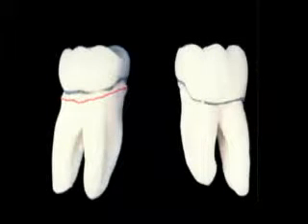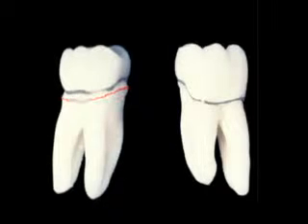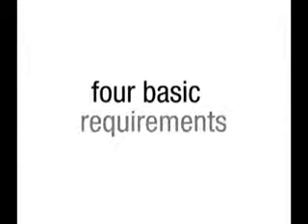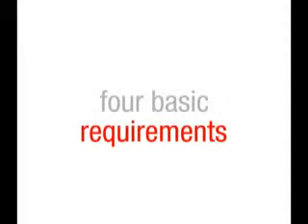In the case of this patient, 2 molars were fabricated from impressions made by 2 different dentists. A well-trained technician fabricated both crowns, but could not improve on the poor impression. There are 4 basic requirements which must be met in order to assure good tissue management.